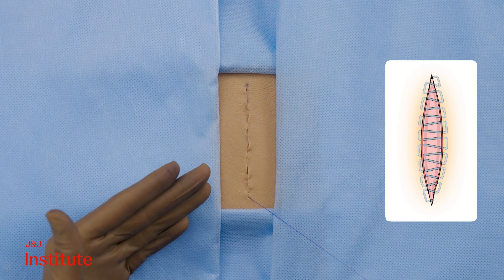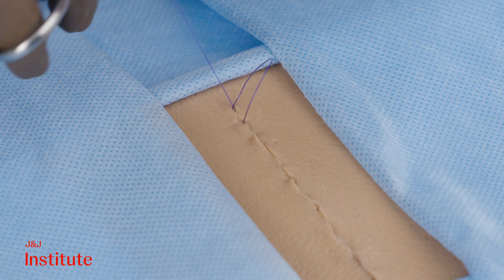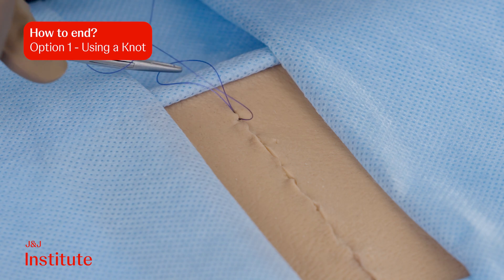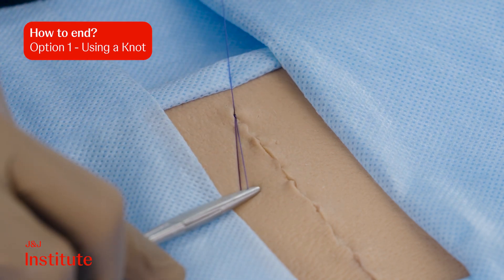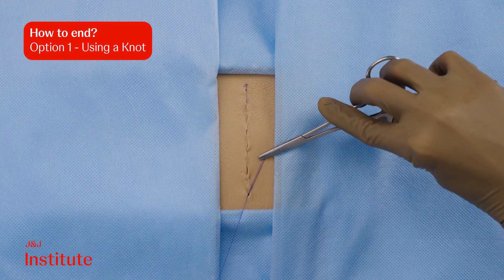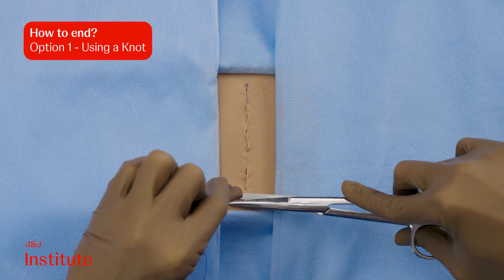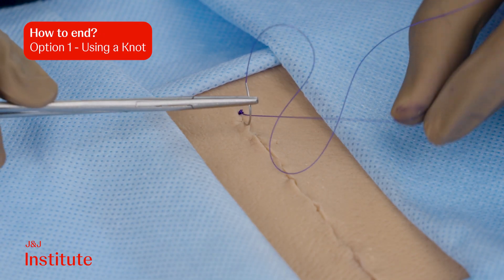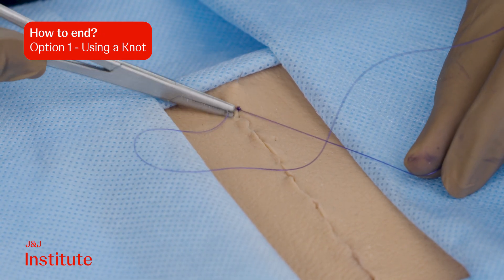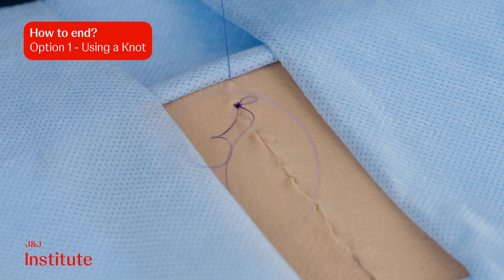This ensures that when tightened, the wound edges come together well. Ending the closure can be accomplished in a few ways. One method involves performing an Aberdeen or a surgeon's knot, which is then buried into the incision by passing the needle through the end and emerging some distance away.